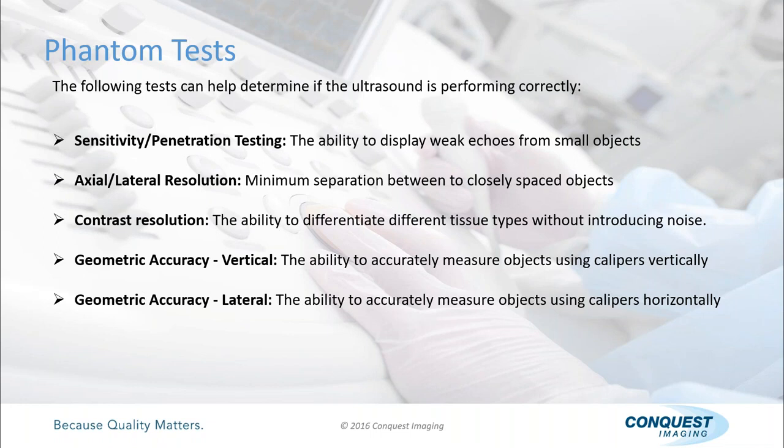Axial lateral, we already saw pictures on that. Two objects close together. Again, I have another document that I'm going to show here after I'm done with the presentation. Eight pages, we'll go over it. It has just wonderful instructions, how to do the test, what you expect to see out of the test, and it's written in very nice, simple English, so we're not trying to be physicists when we're reading it. It's really nice for the common person when we're trying to look at a phantom.